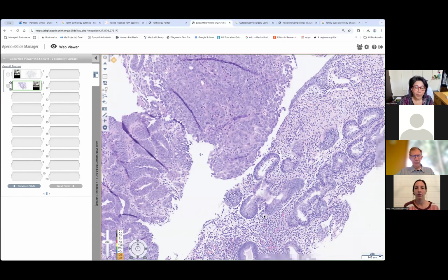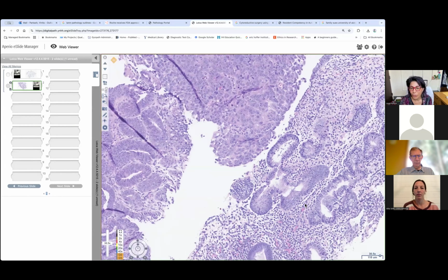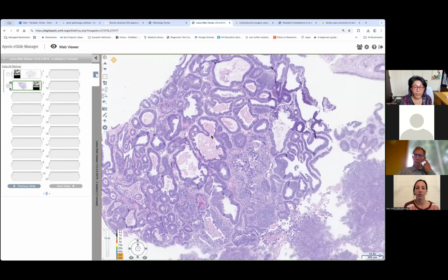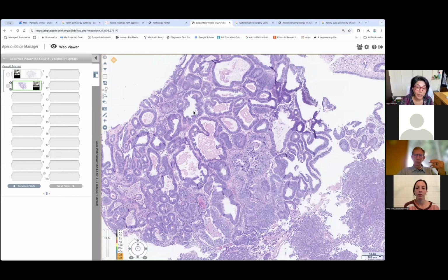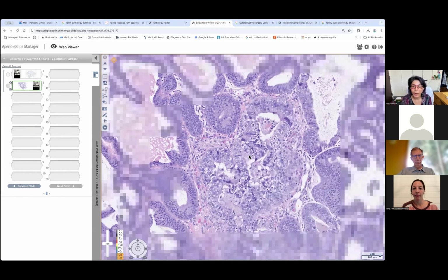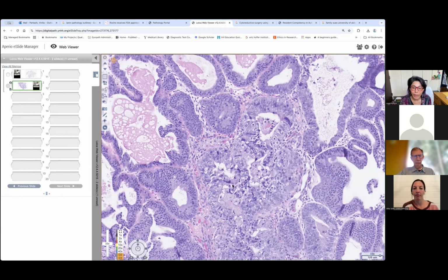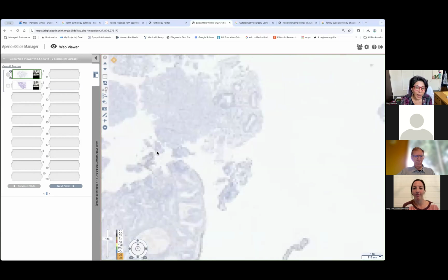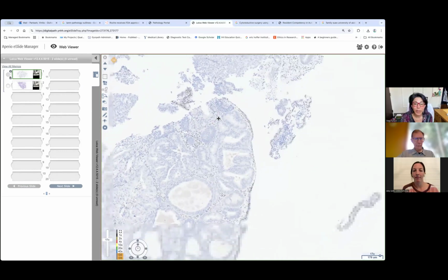So clearly there's the endometrial polyp, which is at this point irrelevant. There are two histologic patterns that we're seeing. One is this tubular type pattern, which on low magnification makes me think of endometrioid neoplasia, where some of it may be atypical hyperplasia, and then some of it becoming more complex and carcinoma. But the degree of cytologic atypia is too high for it to be simply endometrioid carcinoma. The very large nuclei and nucleoli are very concerning for a high-grade neoplasm. Sorry, it takes a while to respond. And so this is the P53 stain.